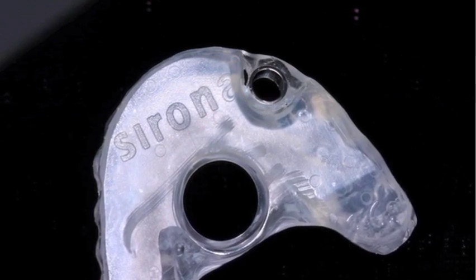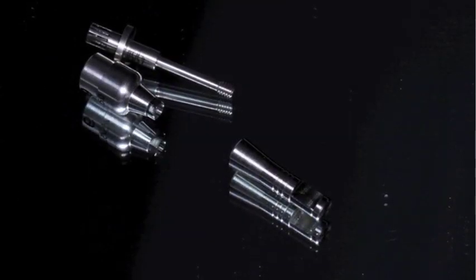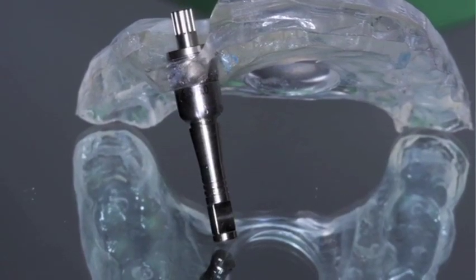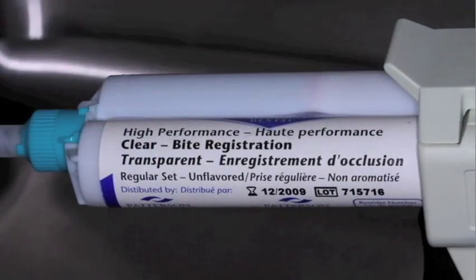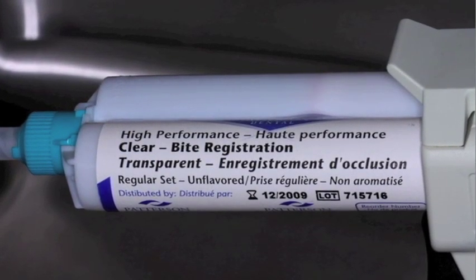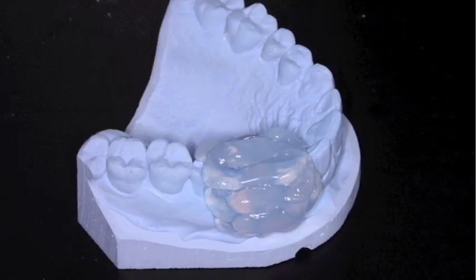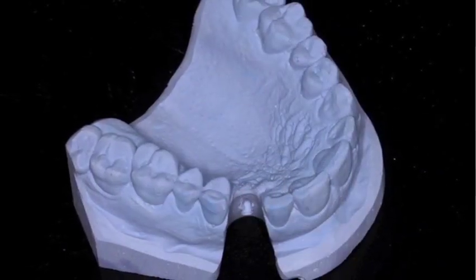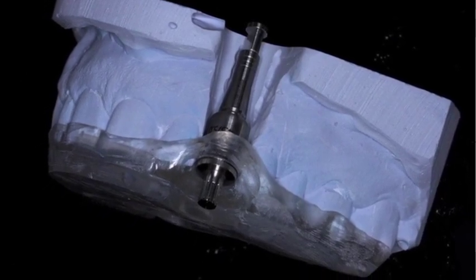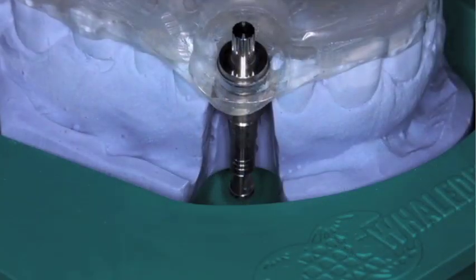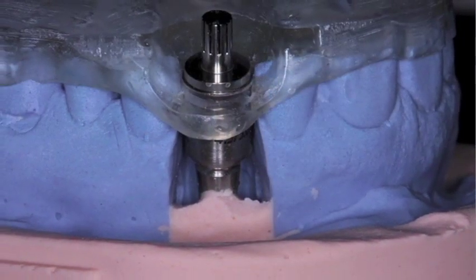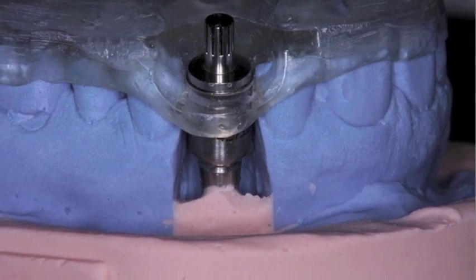At appointment two, we actually get our surgical guide. This is a fixture attachment that attaches directly to the surgical guide. This allows us to simulate the implant placement on a model prior to any surgery. What we're doing at this point is indexing the soft tissue relative to the cast, notching the cast, and then mounting the implant fixture using this attachment. We'll pour this up so that we lock the fixture into a stone model, and this allows us to simulate surgery on the cast.